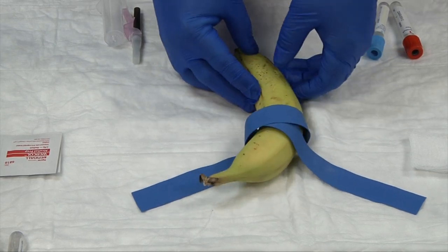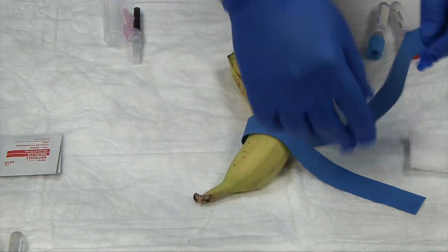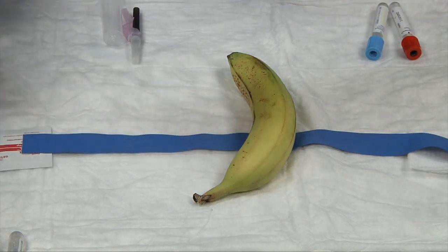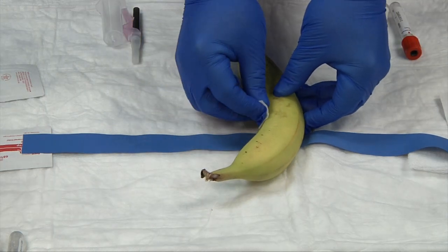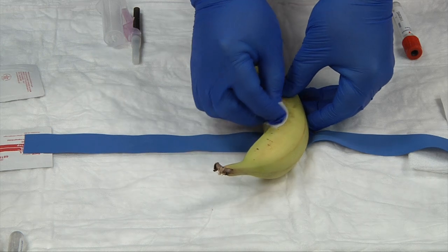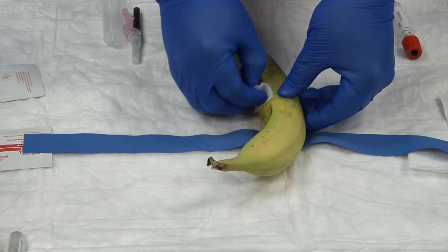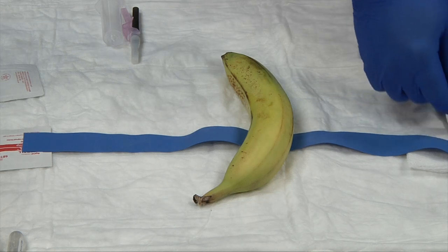As a new phlebotomist, until you pick up your speed, you'll want to release your tourniquet for a minute while you cleanse your patient. Take your alcohol swab and start in the center where you'll do your puncture, then go in a circular method from inside out — never back in. We want to push the dirt away from the site.